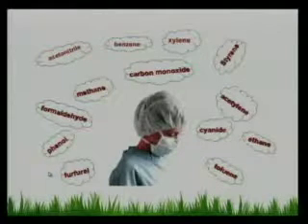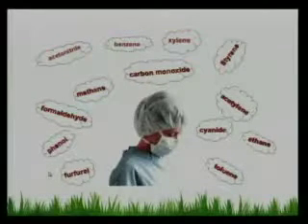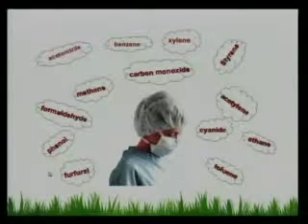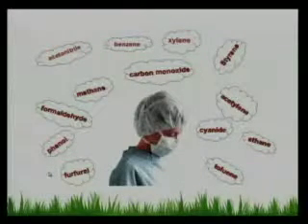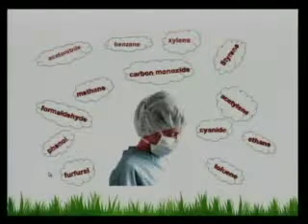There are a lot of devices out there that can help clear the smoke and make it safer. This isn't an issue for the patients, it's an issue for us. It's an issue for the nurses. Long-term effects, I don't think there's any good studies that really show harmful effects from the stuff, but you know, it's carcinogens and irritants and bad crap in there. So protect yourself and advocate for some of these devices.